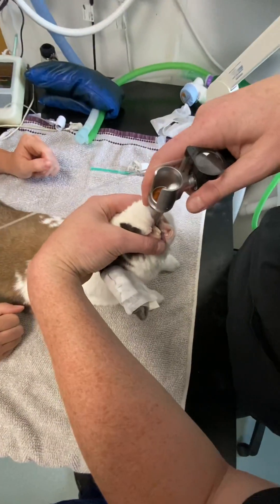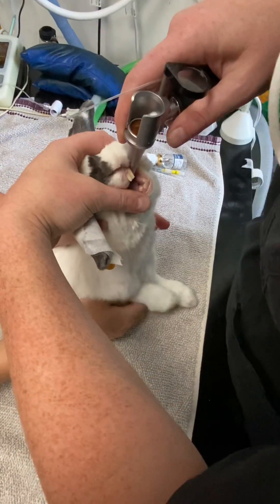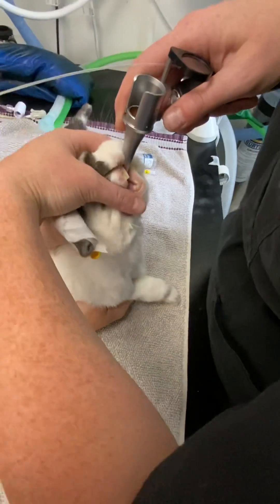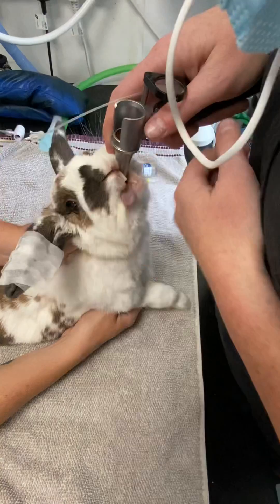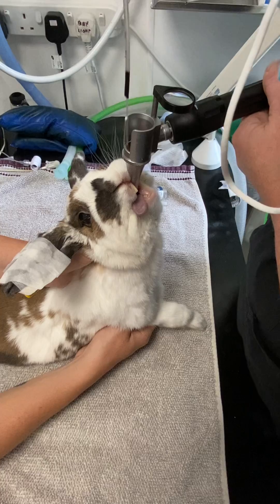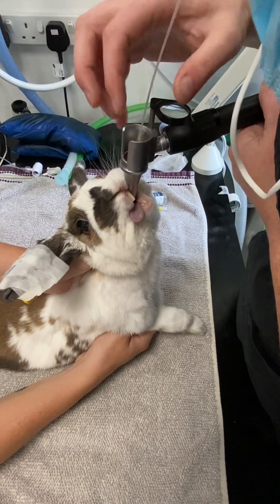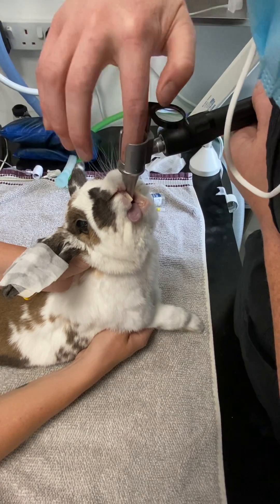Place the stylet down that airway into that hole and then thread the endotracheal tube over the top of it. You can see our epiglottis over the base of the tongue and we can see it moving around. Now, place our stylet into the airway, hold the top, thread the tube over the top and into the airway as well.